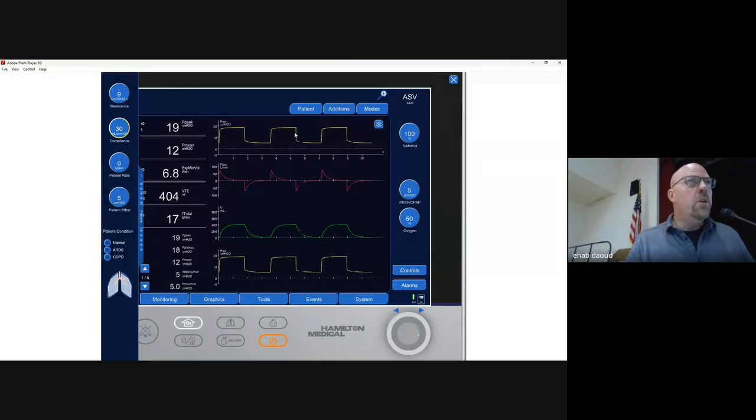But again, using the simulator, you can quickly teach somebody, hey, when the compliance does this, you can expect the response of the scalar waveforms to look like this. Ron did not need to go grab a ventilator or have one transported to EHAB's conference for that particular reason.